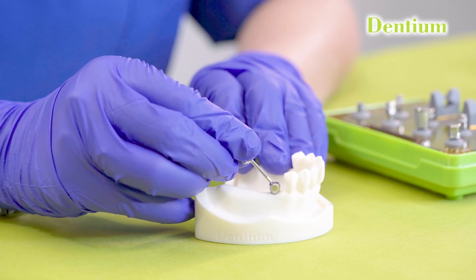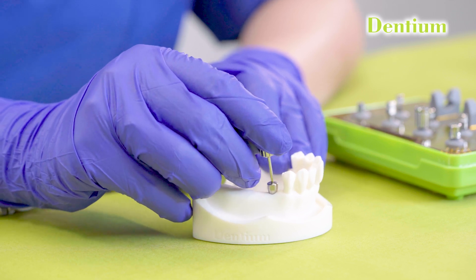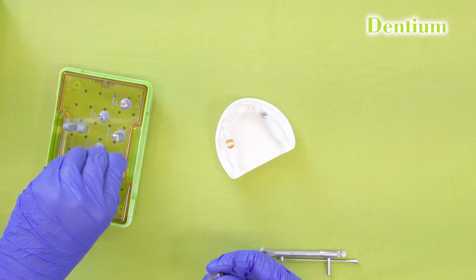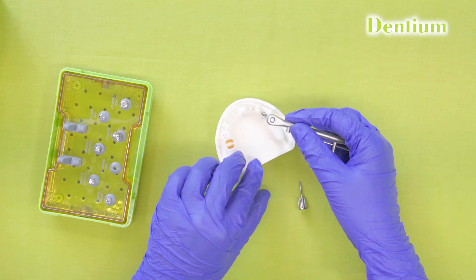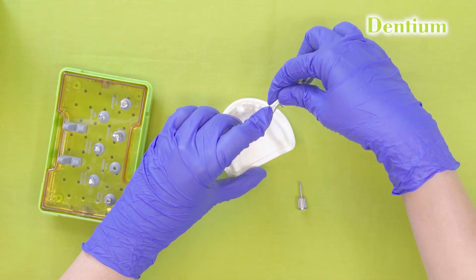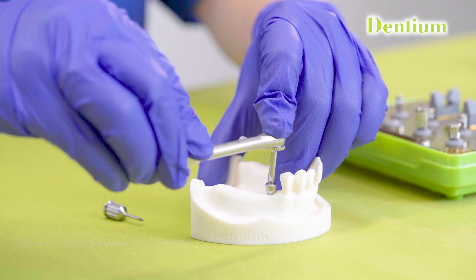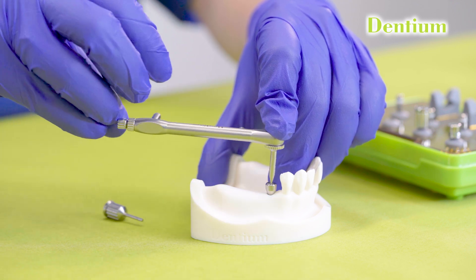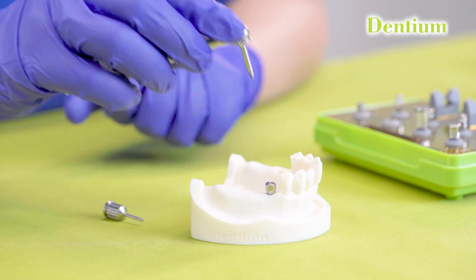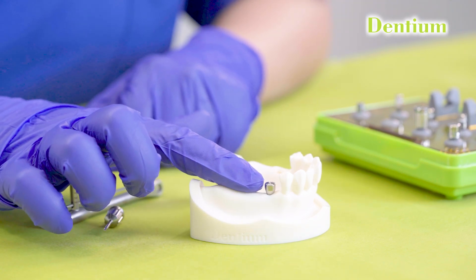In some cases, the hex slot of the healing abutment is destroyed or worn out, and then the hex driver does not seat properly inside. In those cases, we can use the slot driver. The slot driver is fitted inside the torque ratchet, seated inside the slot of the healing abutment, and rotated in the anti-clockwise direction to remove it. This process is used to remove a tightly seated healing abutment in cases where the slot is worn out. All healing abutments are manufactured with a slot for this purpose.